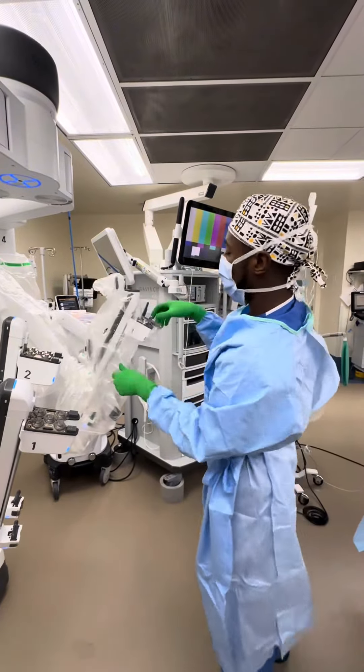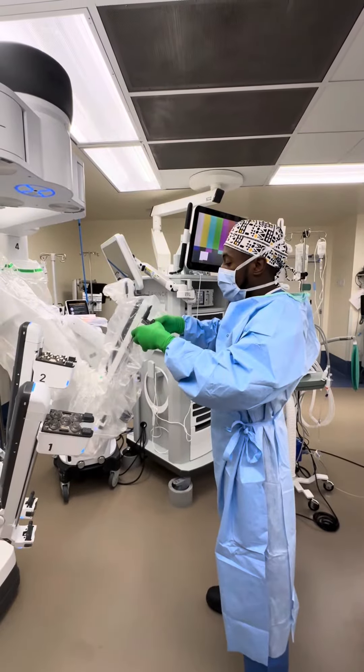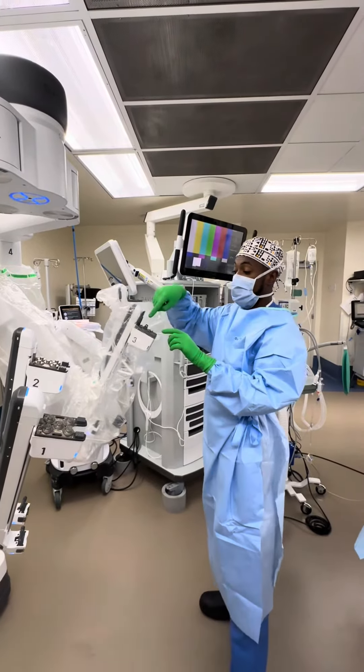Pull it down, and then you connect this piece here like that. You know it's put on properly when the discs start to spin.